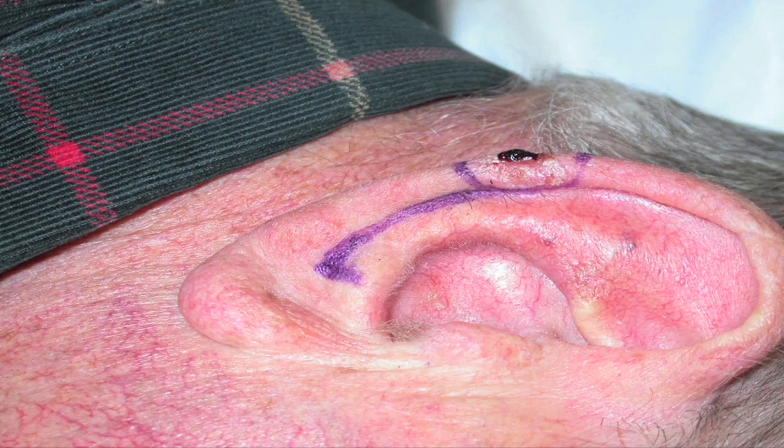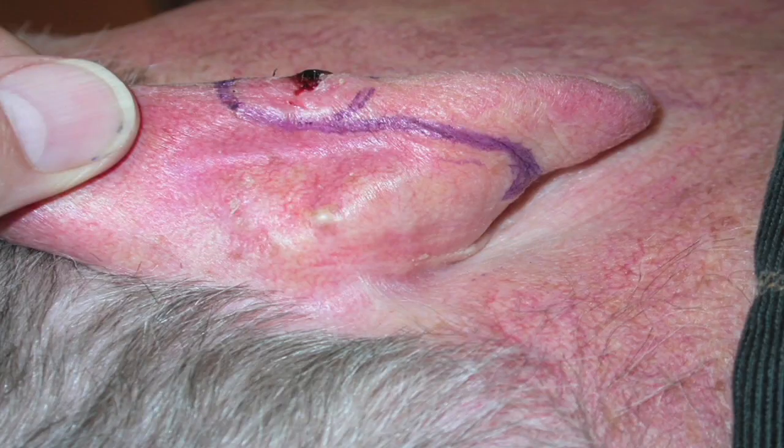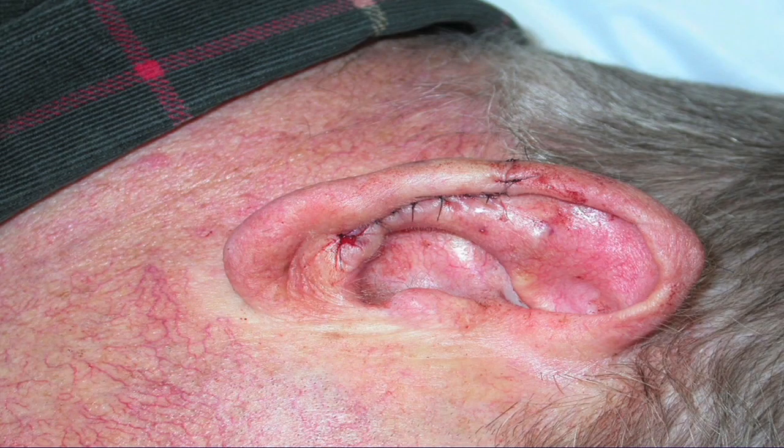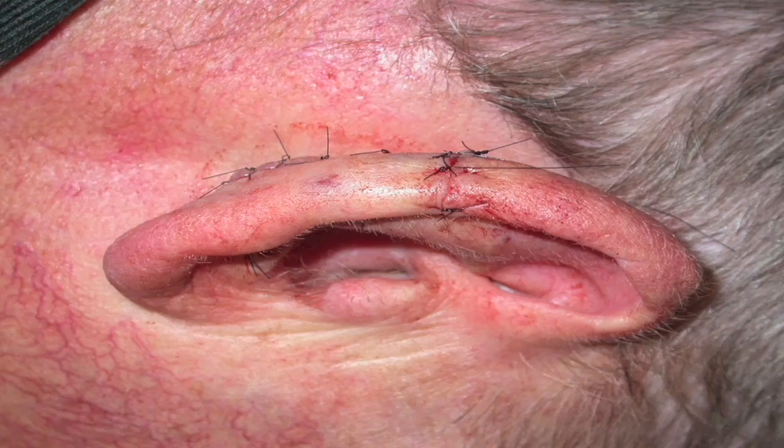And here's my markings to move the skin up on the anterior side. Here's my markings for moving the skin up on the posterior side. Now, if you can imagine if you folded this out, this would look the same as up on the forehead. We're moving a piece of skin forward. So helical advancement is really just a single stage advancement like on the forehead, just it's around a corner of the ear. That's it sewn up there.